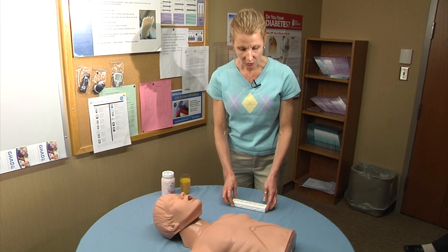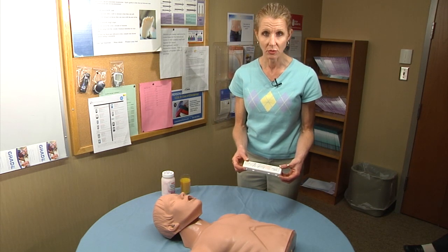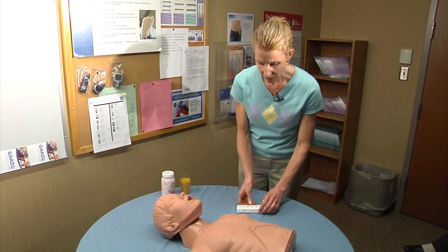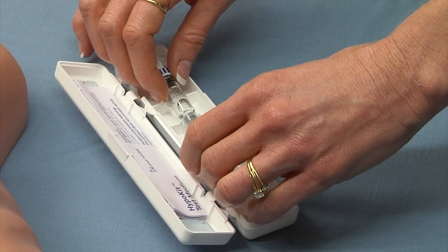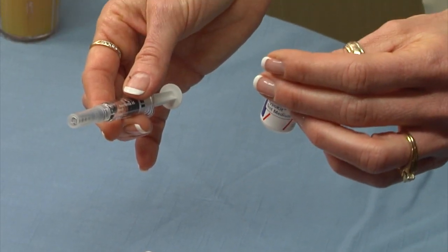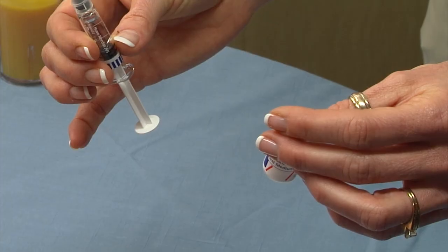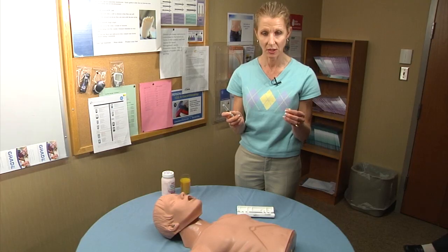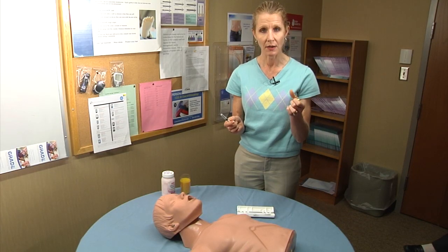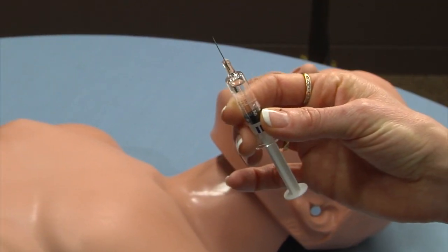The first thing to do in a hypoglycemic emergency is to retrieve your glucagon kit and open the kit. You're going to find two things inside: one is a vial which will contain a powder medication, and the other is a syringe which has liquid solution in it. You're going to flip off the top of the vial and pull off the cap to the needle on the syringe.